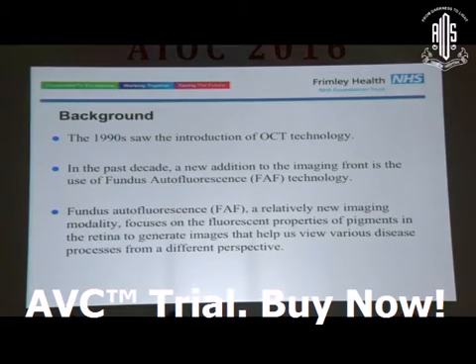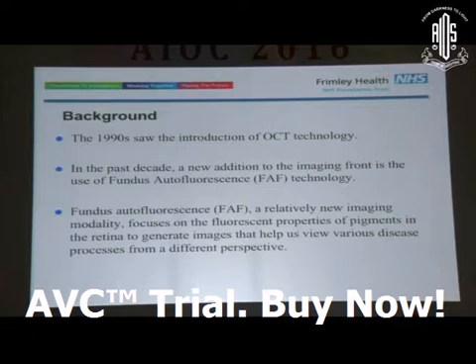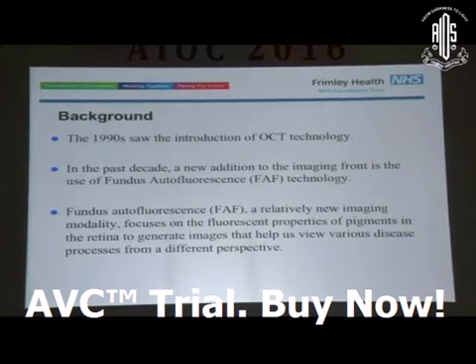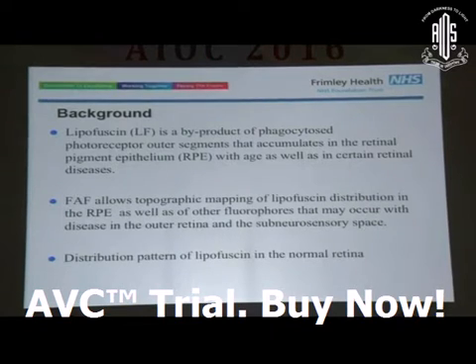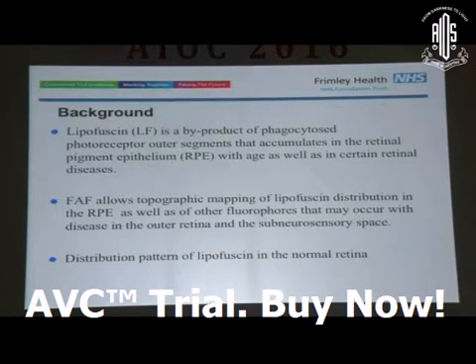Fundus autofluorescence, a relatively new imaging modality, focuses on the fluorescent properties of the pigments in the retina and generates images that help us view various disease processes from a very different perspective. We all know that lipofuscin is a byproduct of the phagocytized photoreceptor outer segments that accumulates in the retinal pigment epithelium with age, as well as with certain diseases.